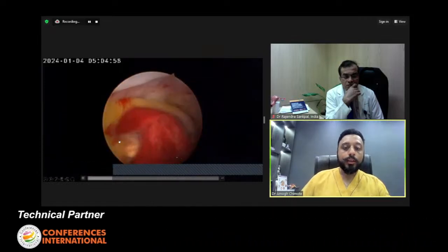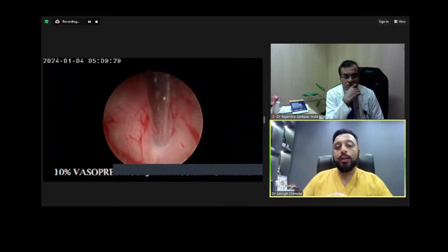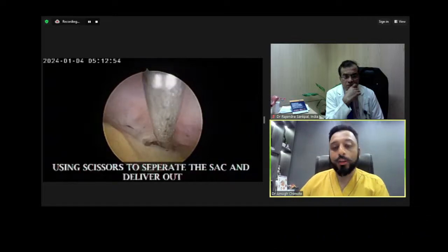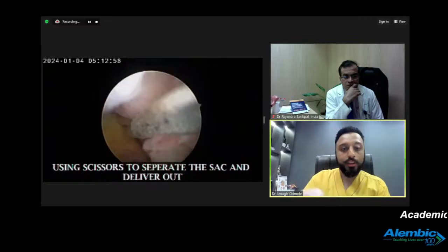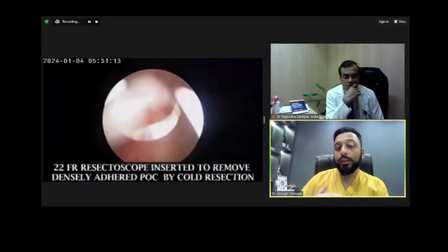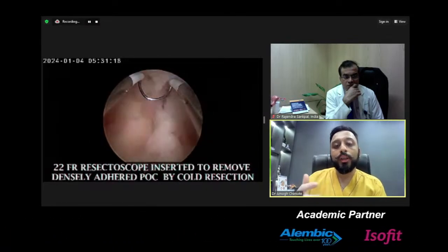Here again, as I progressed with the procedure, I started using vasopressin at the base of the sac, set up with my mighty and trustworthy scissor, and went about a circumferential incision of the gestational sac as I had shown in the first video. After complete removal, yes, there were some parts which were not easily removable with a scissor.